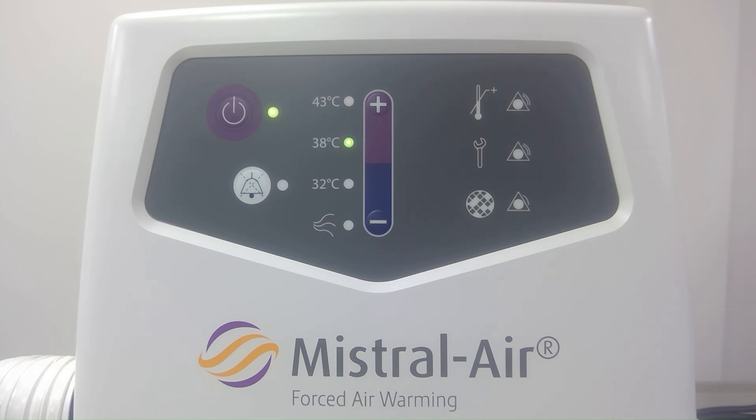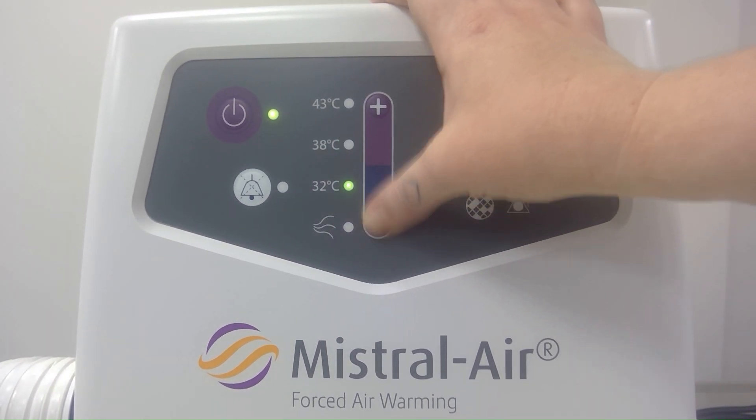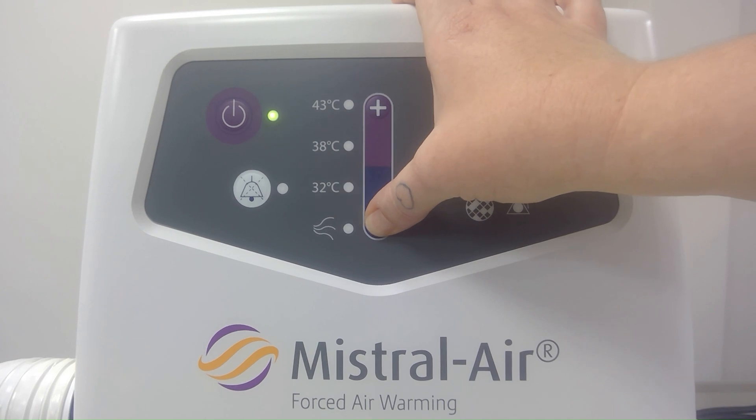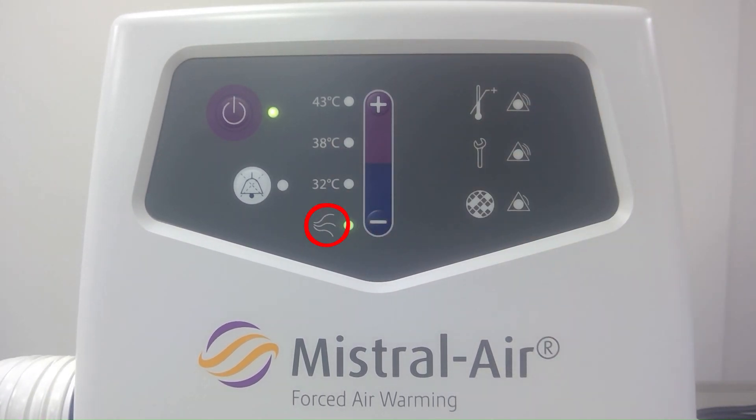If we're wanting to adjust this temperature we can do so with the plus or minus buttons. The LED is flashing as the unit warms up until this temperature is reached. The LED has stopped flashing and we know that it's now reached a temperature of 43 degrees. To enter an ambient air mode we can just move down to the symbol with the three wavy lines, and this will start blowing ambient air towards our patient.